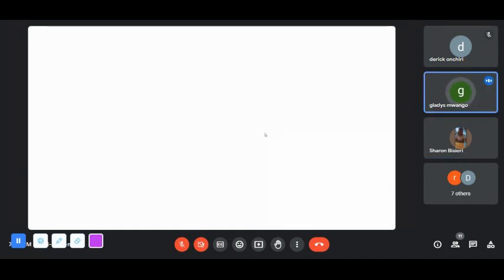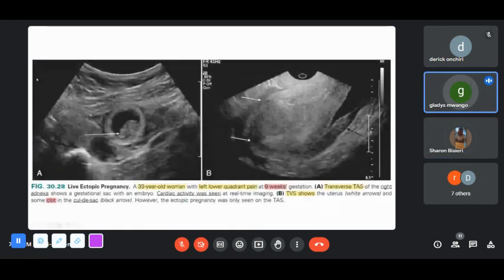Yeah, that is true. Because remember, when you apply the pressure, you're reducing the amount of tissue that the sound waves are going through. So it improves your spatial resolution, right? Yeah, quite a bit. It's the same way as when one is doing a physical exam and you did a bimanual palpation. It's the same kind of science or technique that you're applying. All right. Okay, thank you.